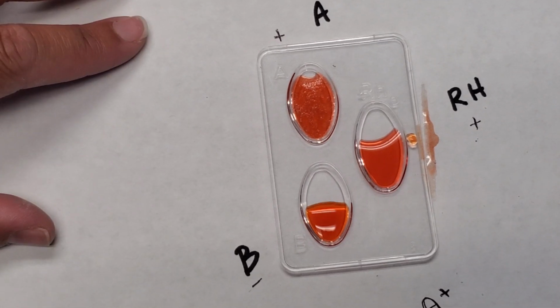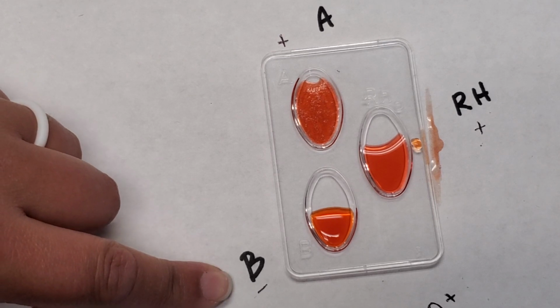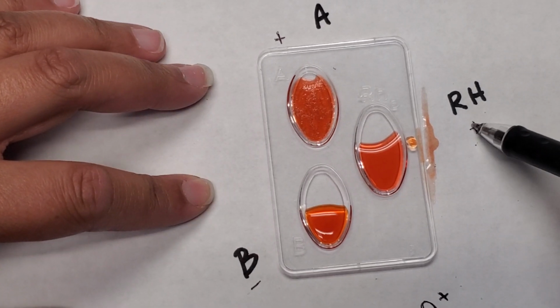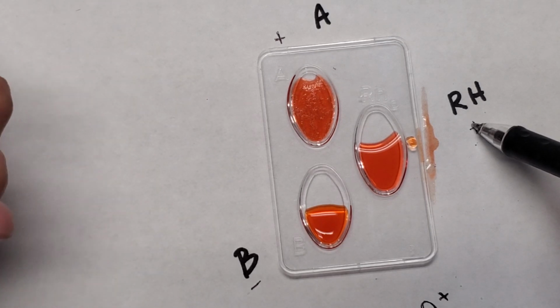Let's give another example, okay? What if we had agglutination in well A and in well B? That would mean that antigen A and B are present, in which case it would be blood type AB. What would happen if the Rh clumping or agglutination was negative? That means that it would be an AB negative blood type, okay?